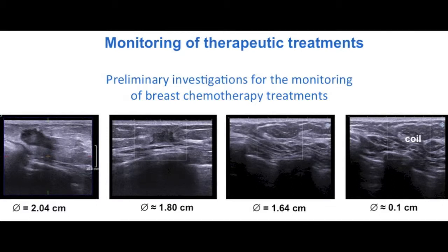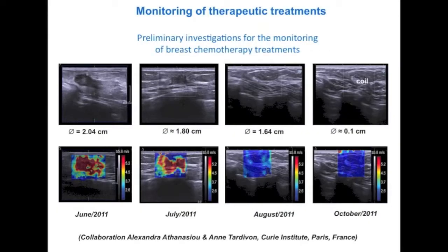If I use the same exact dynamic range, which is now possible because you have these numbers displayed next to the color scale, at time 0 and t0 plus 6 months, let's say, and if I see changes in the pattern of ShearWave, then I know that it is because the organ has changed, the lesion has changed.